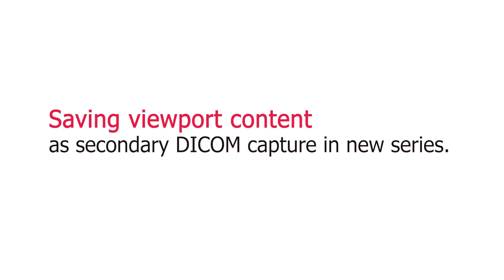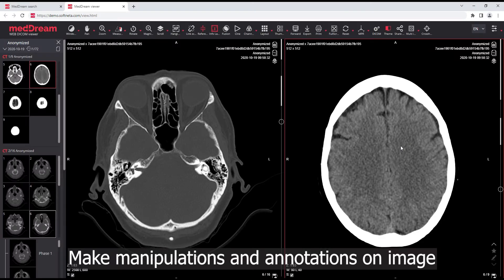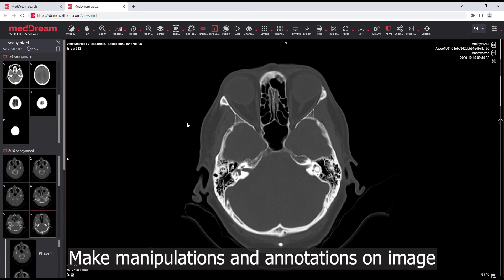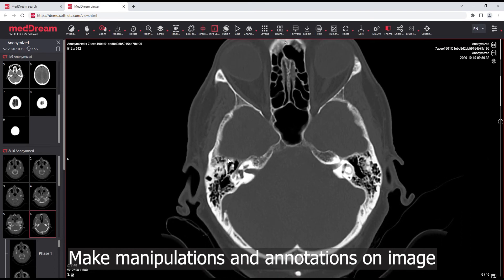Saving viewport content as secondary DICOM Capture in a new series. Make some manipulations and annotations on the image.